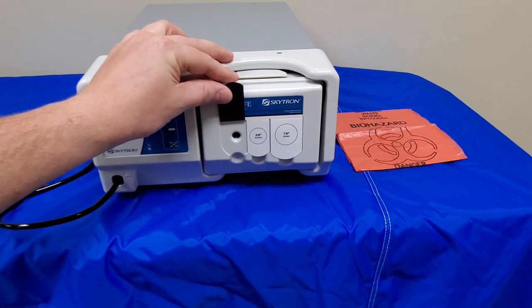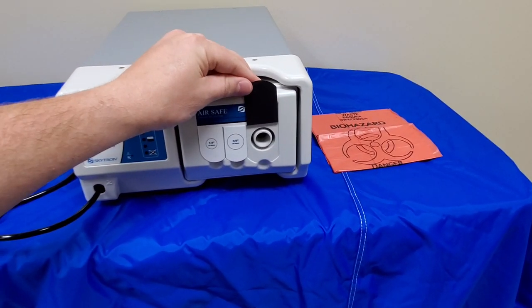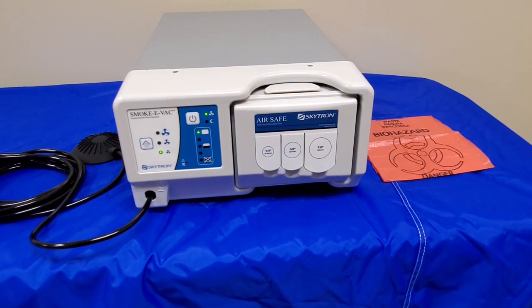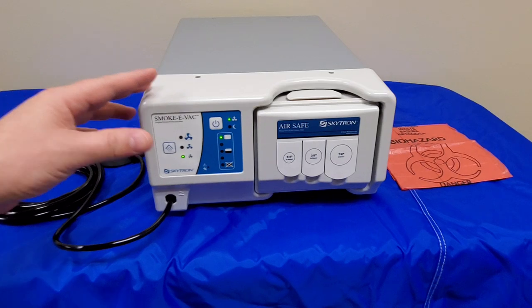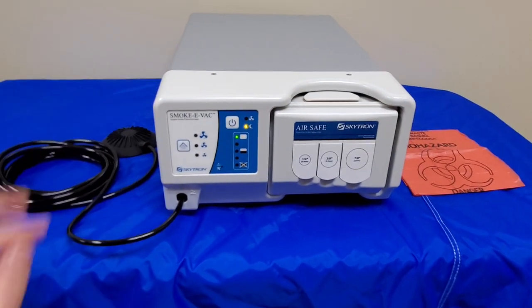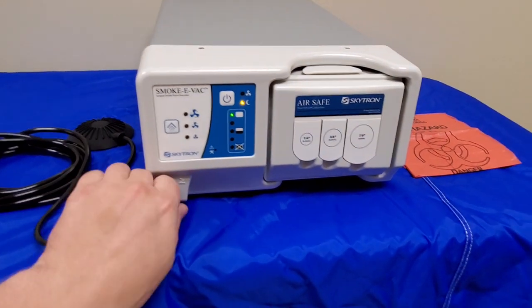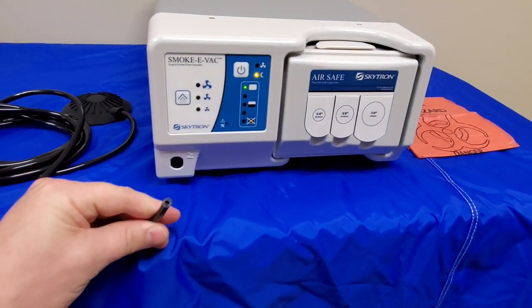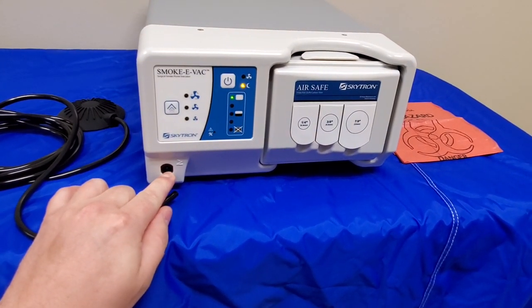We have three ports here for different size tubings. There are various ways that you can use this unit — we're not going to go into that on this video. One of the other things I want you guys to know is that this does not necessarily need a foot pedal. The foot pedal is just a tube that plugs on to a hose barb.